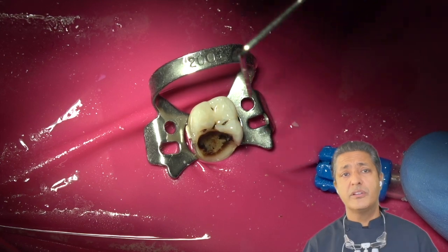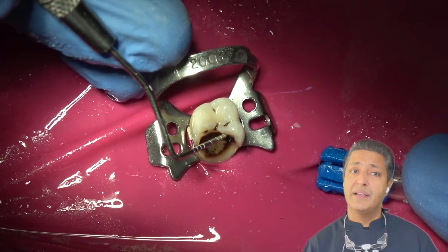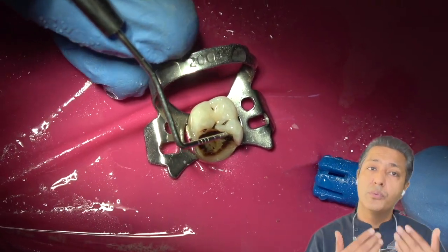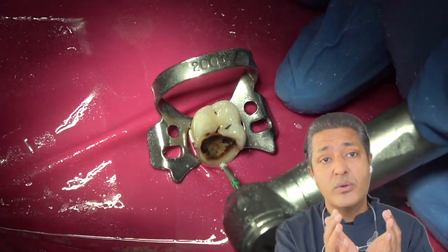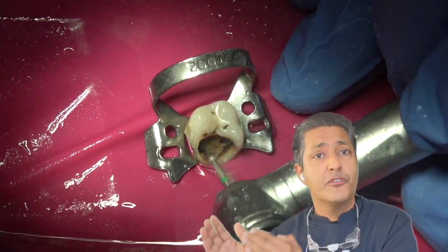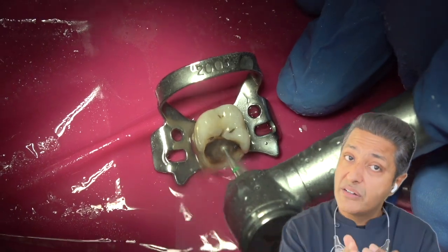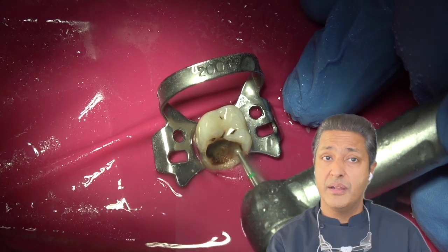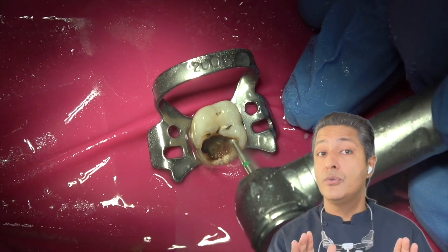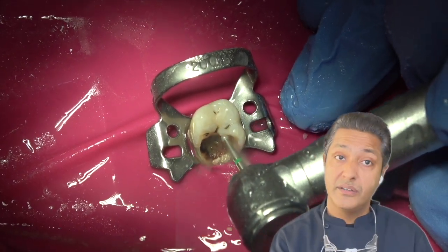Once we are sure the peripheral excavation is complete, this is the time when we move towards the central part. We are basically trying to narrow down the operating field, starting from periphery, going towards central caries excavation, and then finally entering into the pulp chamber. We are not in a hurry to do so, as I told earlier.